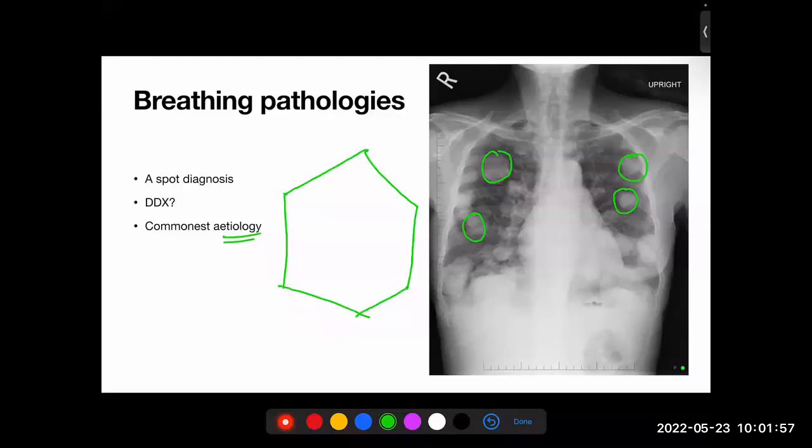We start like this. Are you seeing my screen? What does that remind you of? You have never heard of something called a benzene ring? So what is down here? If it is a man, it is prostate.